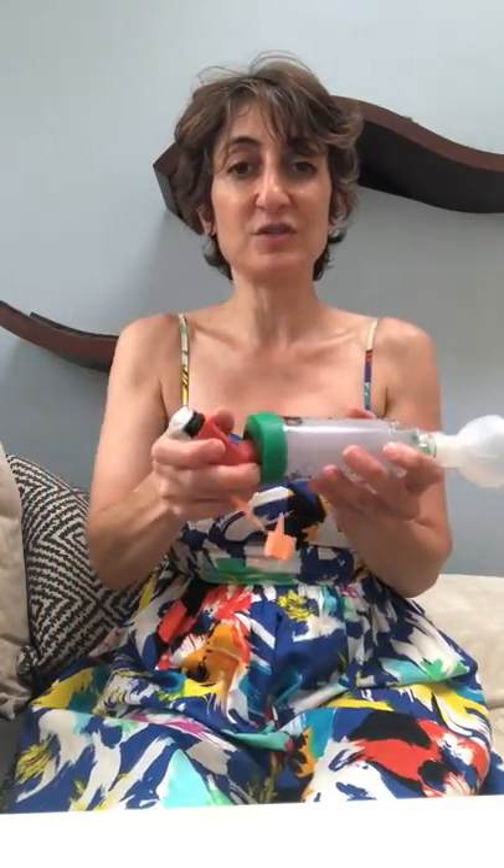Then what I always do is I personally take this out, because I don't want to forget that you have to shake it. If I leave it here, I might just pick it up tomorrow and pump it. So you do have to shake it, which is why I take it out every single time.